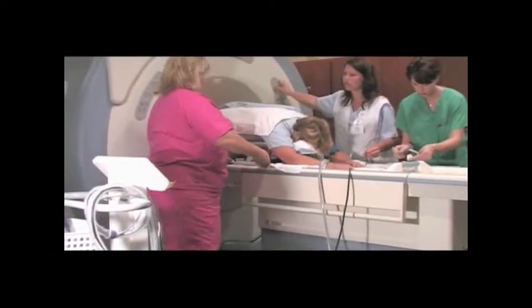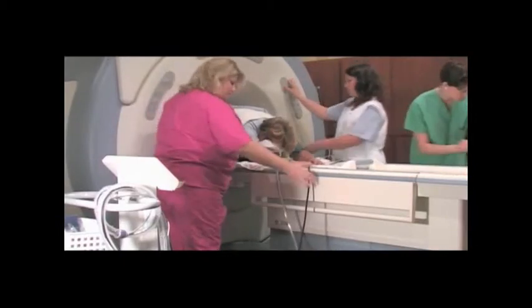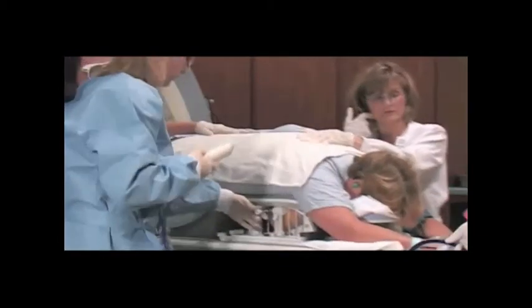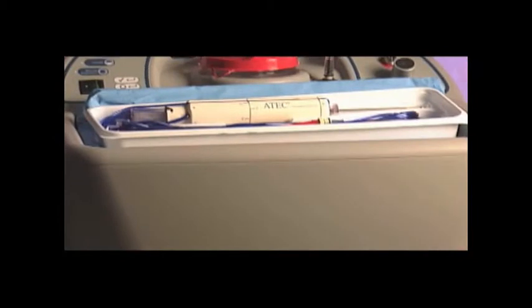MRI breast screening is a recommended secondary screening method for high-risk women in addition to mammography. MRI-guided breast biopsy is a minimally invasive option for diagnosing the clinical outcome of suspect lesions identified by MRI. The Suros ATEC Sapphire and ATEC Emerald Breast Biopsy Systems are designed for this procedure.